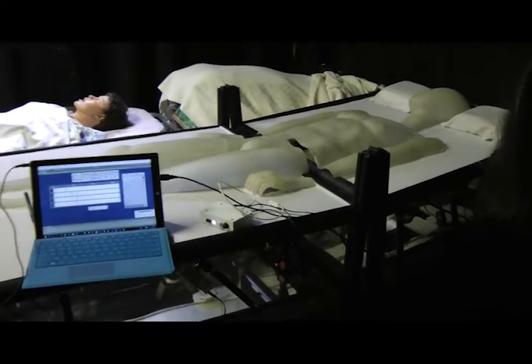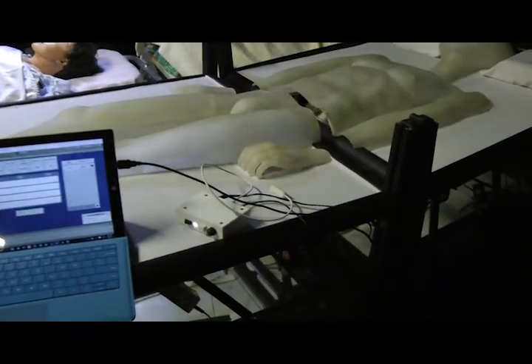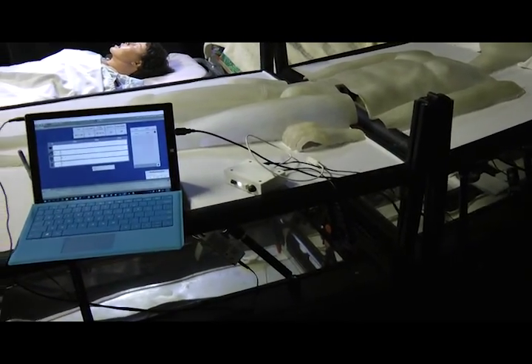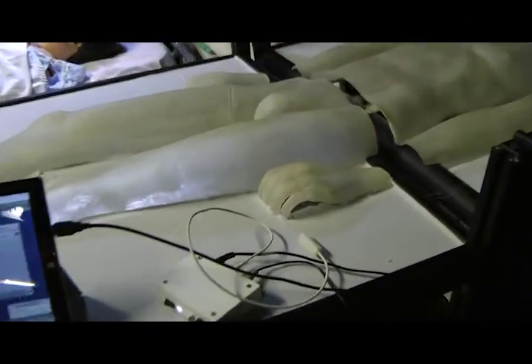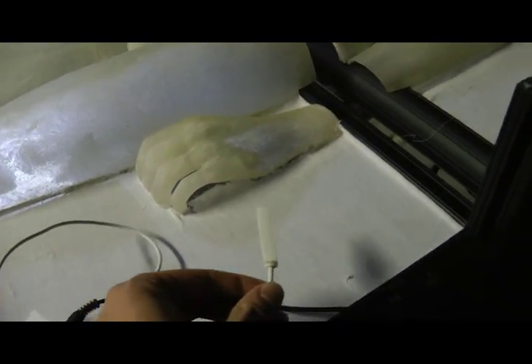So here we have the patient bed. We have our computer here hooked up to both the tactile haptic feedback device as well as our heat pump. And I don't know if you can hear it through the video, but we have our pulsing and also our heat device just kicked in, which are located down here.